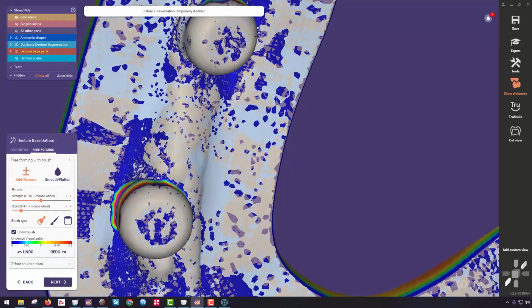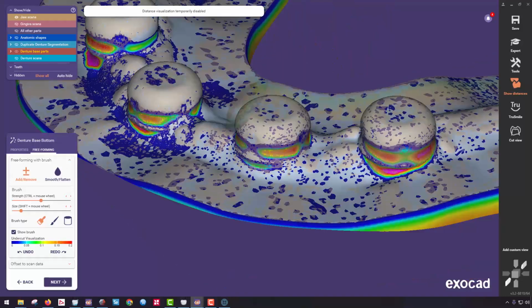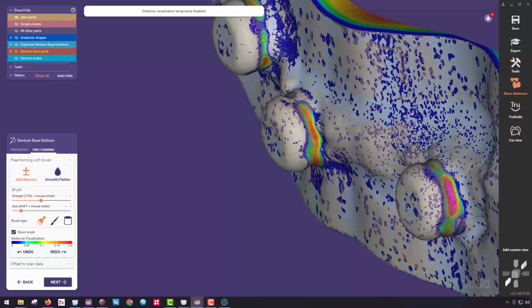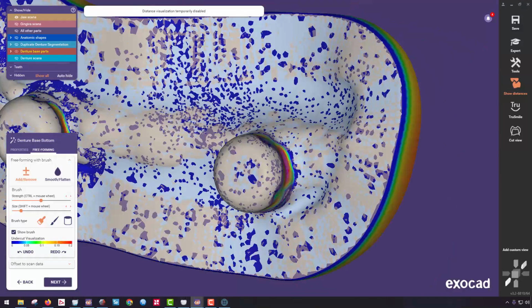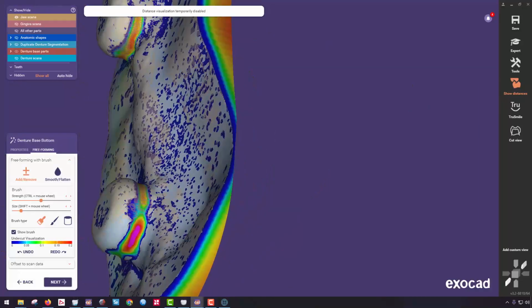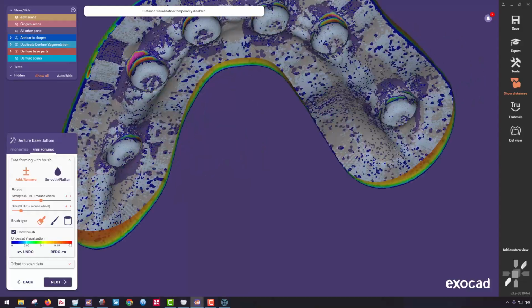And I don't think that there's any block out in there, but it's a good idea. Just maybe it's my compulsion. I'm just going to do this right in here, using my shift key down to add remove, to make sure I remove any of that block out. And verifying it from underneath here. And that looks pretty good.